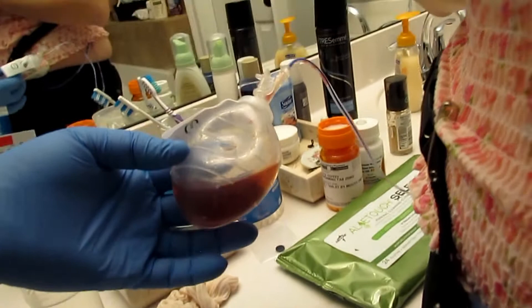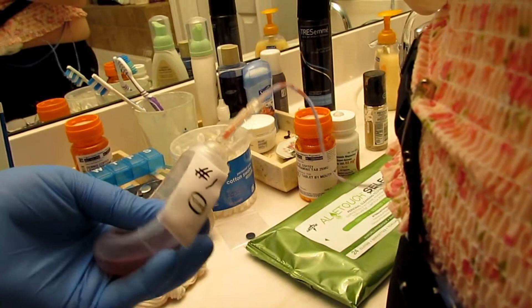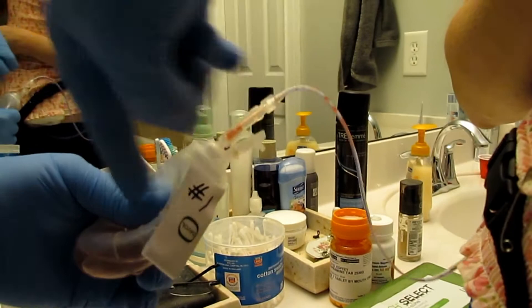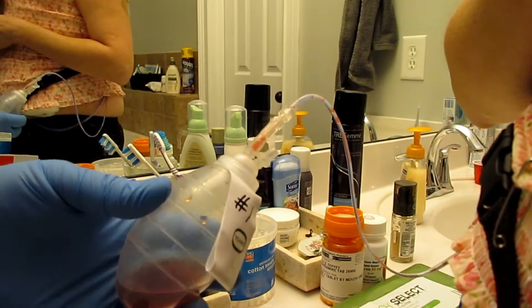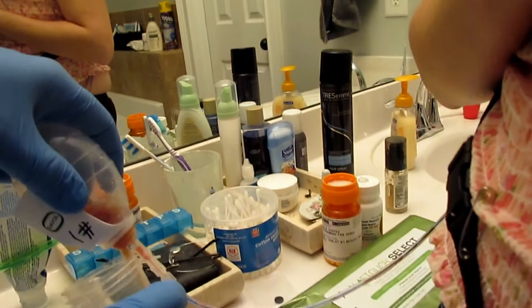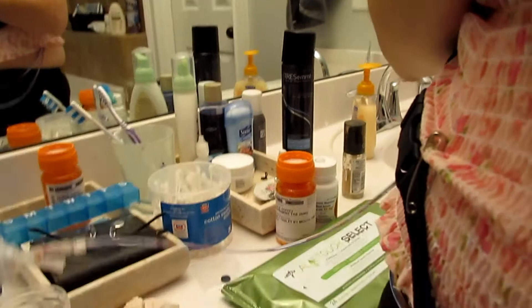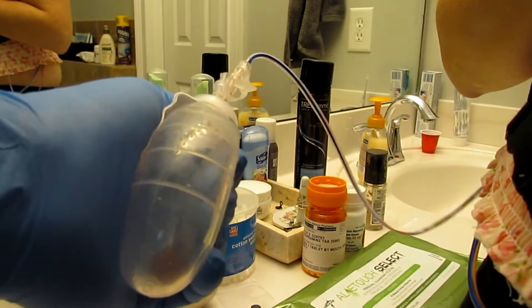It's okay to just leave a clot if it doesn't come out of the drain. You want to be careful — hold the bulb, pull the drain out, then let the bulb expand and drain it. You can drain it into a cup and measure it, or measure it on the side of the bulb, but you have to record each one every time you drain them. When you're done, squeeze the bulb and put the stopper back in to keep suction on that drain line, then move on to the next one.